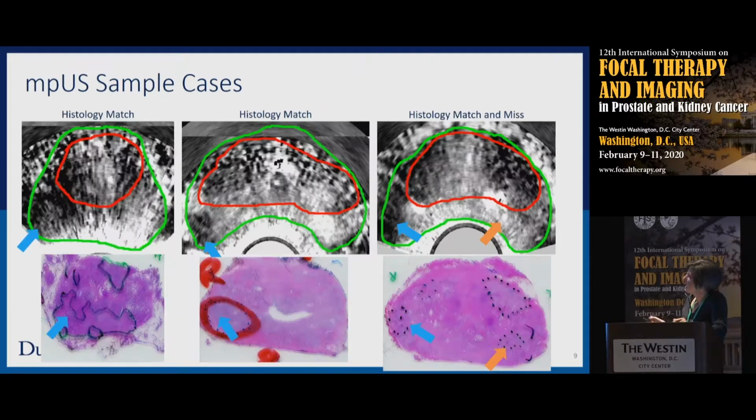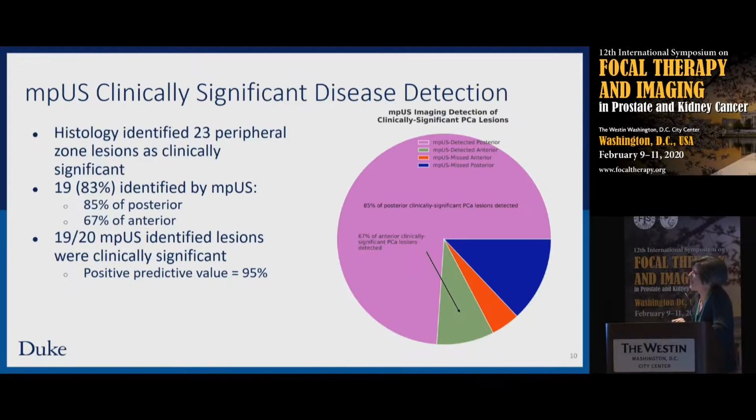But in any case, we've done this with data. This is a new set of 15 patients. So again, these are all small number studies. And what we've seen is that the dark regions do a good job of correlating with cancer. And here's a case where we saw something dark and it was cancer. Another example of a dark multiparametric image with cancer. Here we saw this lesion here, but we missed this lesion here. So we're not perfect in any stretch of the matter.